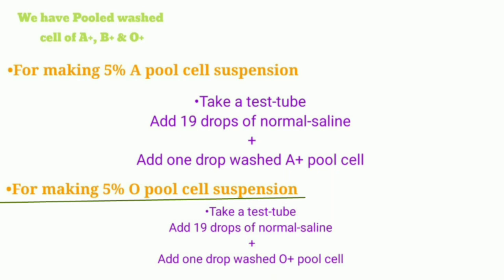If you want to prepare 5% O pooled cell suspension, take 1 test tube and add 19 drops of normal saline and 1 drop of washed O positive pooled cell. Mix well, and after mixing, you have prepared 5% O pooled cell suspension. Just like that, if you want to prepare 5% B pooled cell suspension, take 1 test tube, add 19 drops of normal saline and 1 drop of washed B positive pooled cell, mix well, and after mixing, you have prepared B pooled cell suspension.